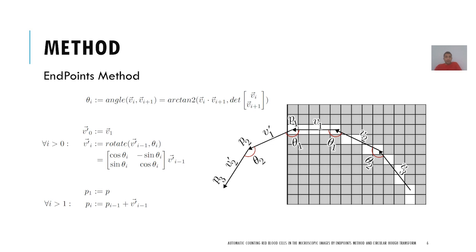The EndPoints method is the main part of our work. As I said before, the EndPoints method estimates the behavior of cropped cells outside the image border, and now I want to explain how it works.